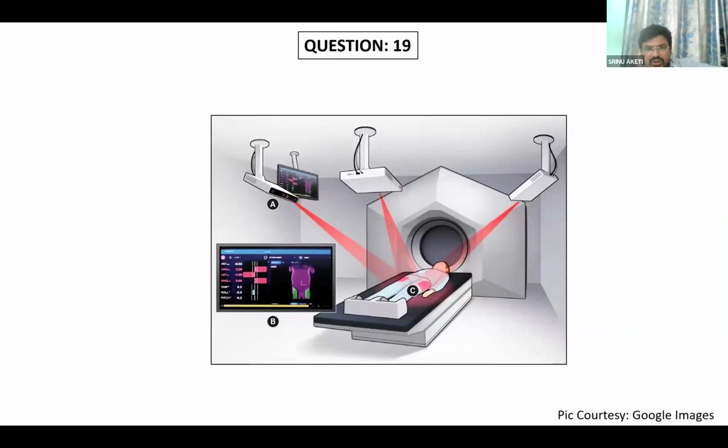So you have some idea about this one? Yes, sir. It is SGRT, surface guided radiotherapy. Can you tell me something, advantages, disadvantages? One or two words. So mainly it has this advantage of intrafraction motion. The setup accuracy will be better with this, sir, without additional effects. You can monitor the patient position continuously during the treatment. That is the advantage. What is the disadvantage?